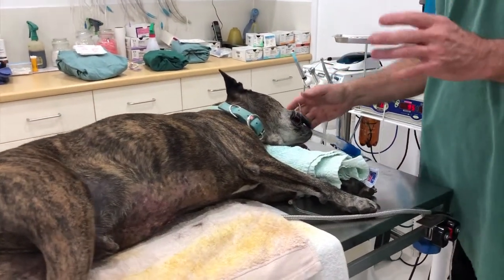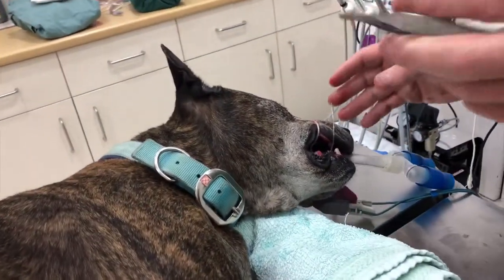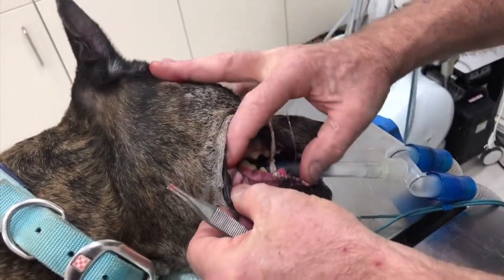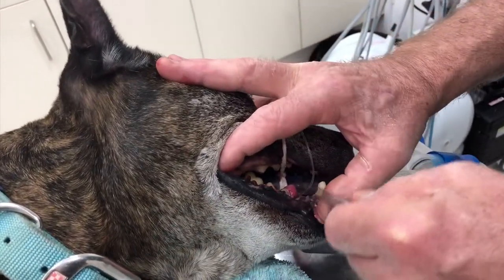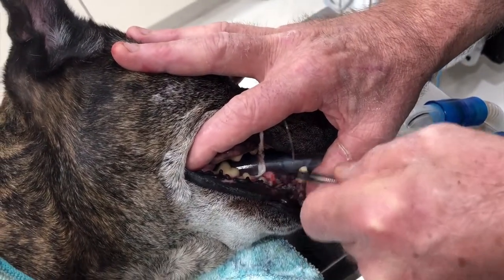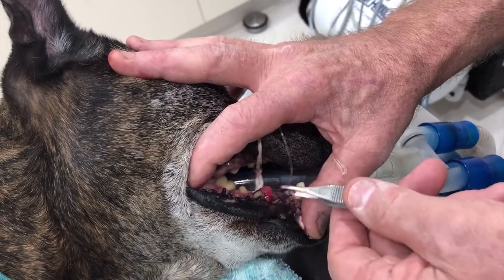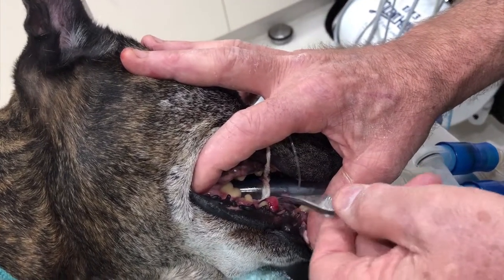I'm just going to turn this light off so you can get a good look. Buddy is in here for a number of reasons today, and one of them is this lump here on his gum. That is an epulis, just like Jack had, but this is a normal epulis — it's benign, it's not cancerous — and we're simply going to cut that out.